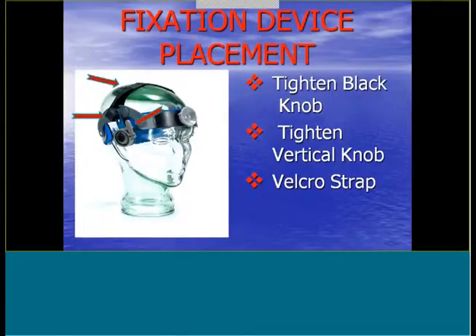Okay, so tighten the big black knob first. This one here, tighten that one first. Adjust the Velcro strap and fine tune with the vertical knob here. So this is your fine tuner.